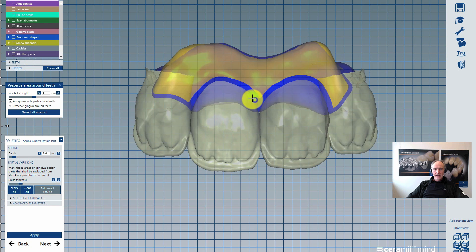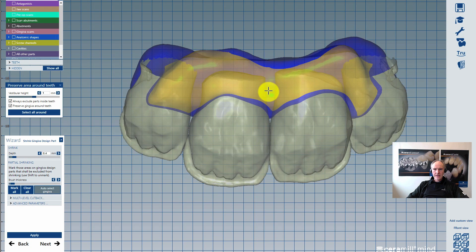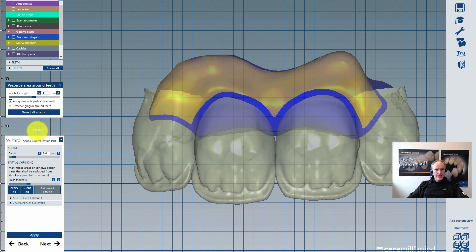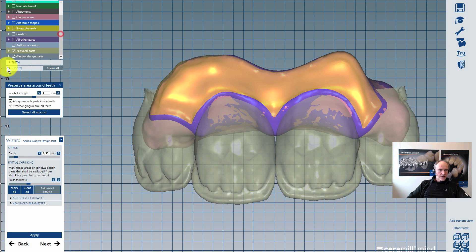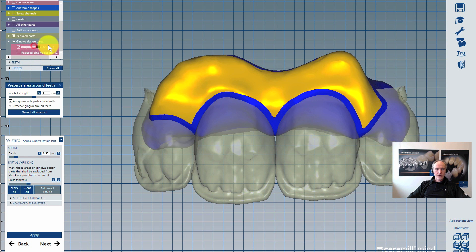In the next step we want to care about the shrinkage of our gingiva. You see these blue parts here — these are protected parts that will not be shrunk. In some areas I don't want to have shrinkage except on the vestibular side, so I protect the completely basal side with a brush tool. The shrinkage is around 0.4 to 0.5, depending on your own desire. Now I click apply, and you will see the shrinkage of the gingiva. The gingiva design has gotten a new result — this is my shrink design, and this was the design before the shrinkage.